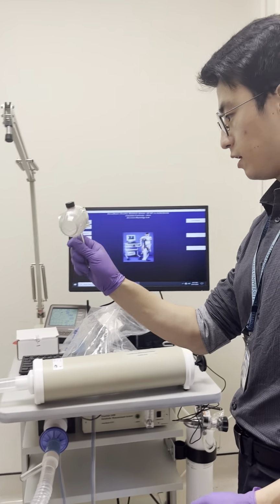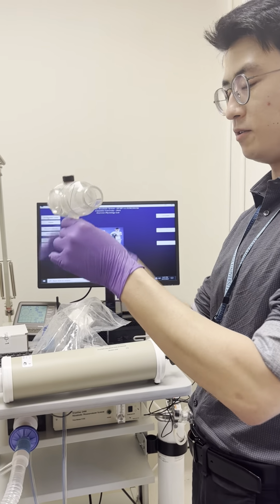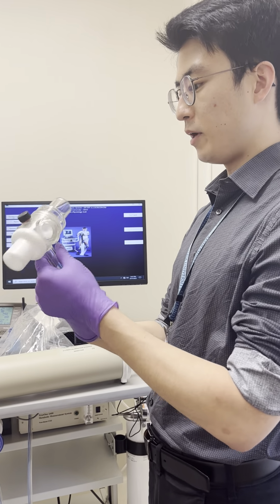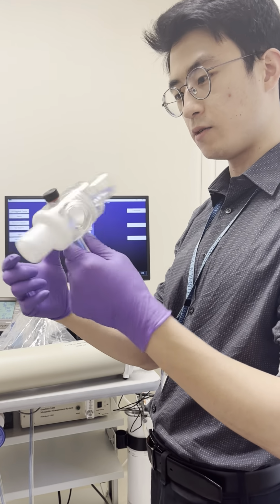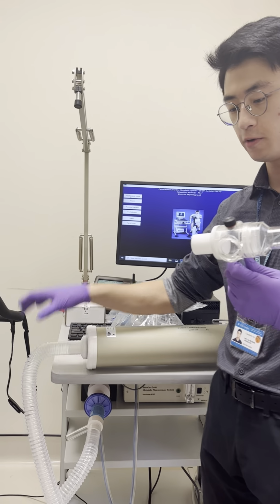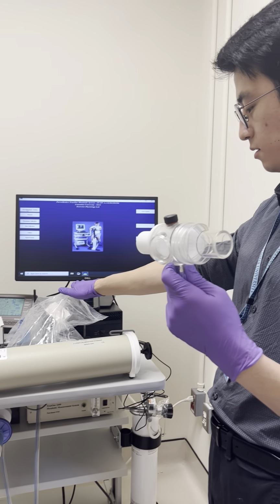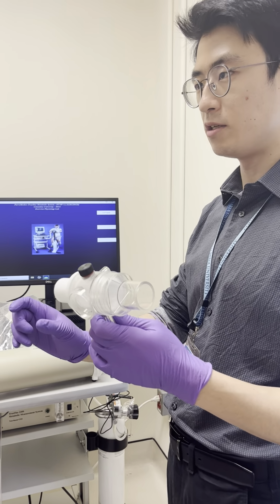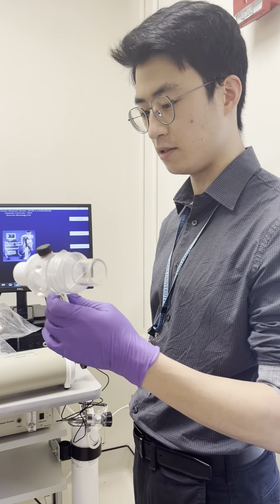So this is a two-way non-rebreathing valve. This right here is a spit trap, because when you breathe out, there's spit and then there's condensate, so this is what collects it. And then there's a valve here, where air comes in one way and goes out another way. This end will be connected to the pneumotach, right? This tube goes into the gas analyzer and the volume meter. It's going to measure the gas content of the breathing, as well as the rate and the depth of breathing. And the product is ventilation.